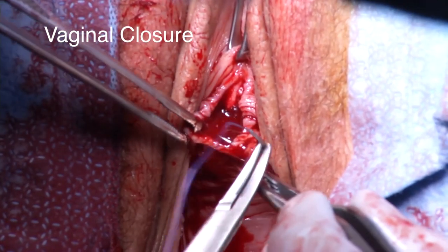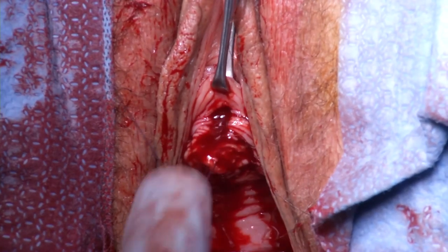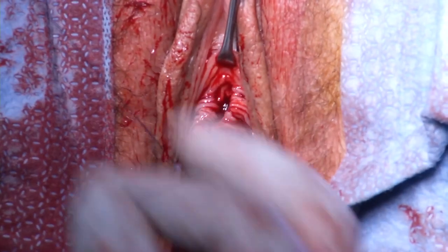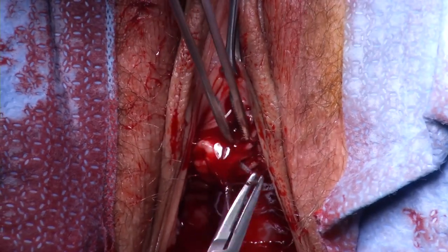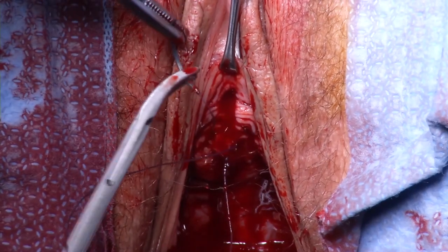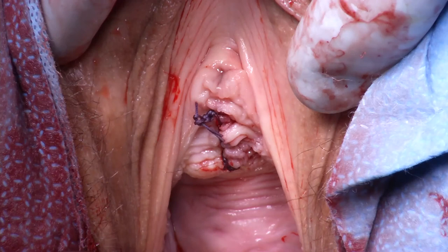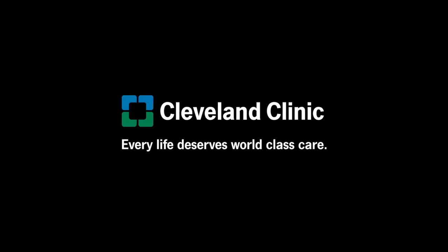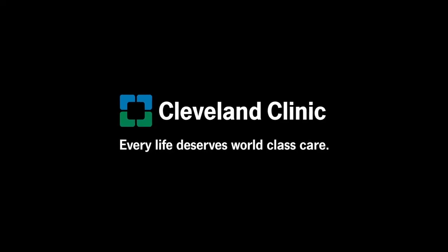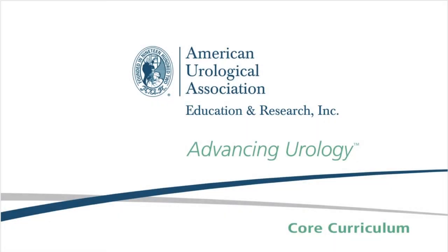The vaginal mucosa is closed in a running fashion using a 2-O polyglactin suture, locking each stitch to ensure hemostasis. After excess mesh is trimmed at the skin level, Steri-Strips are applied. At the end of the procedure, the bladder is left full and the patient is required to void before discharge.